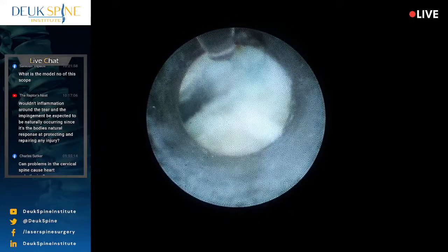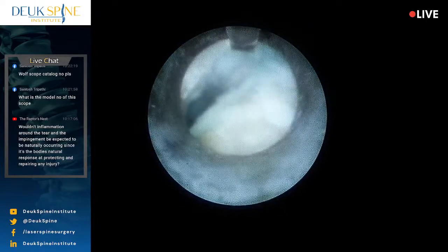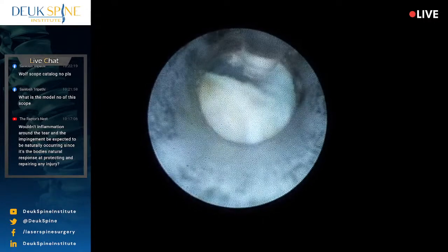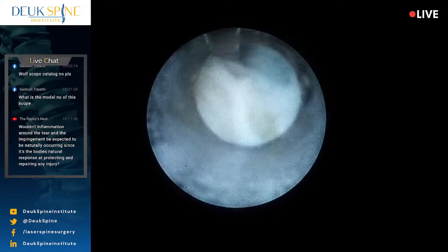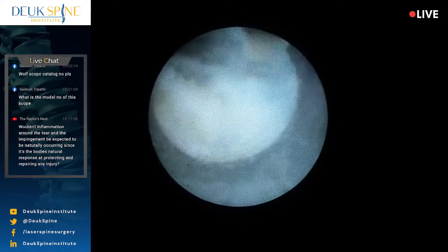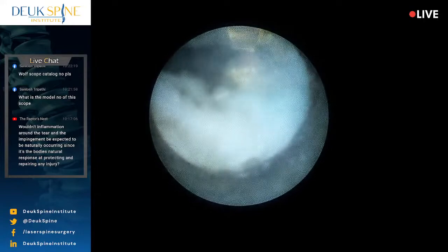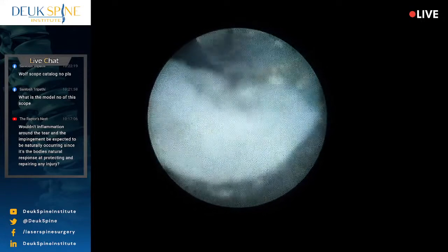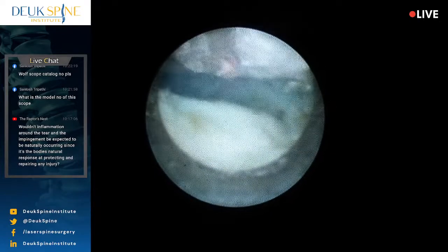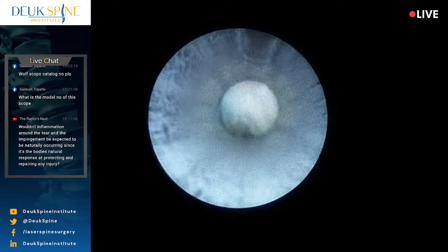It's a little bit fuzzy and grainy. And that's the problem with these fiber optic scopes. They always are a little fuzzy and grainy. All right, so I want to go your way. Right, Luis? And that's what we're going to do. This is all herniation right here. It's kind of just pouring down into space, the epidural space. So it's a bit calcified too. My way. Let's swing it around.